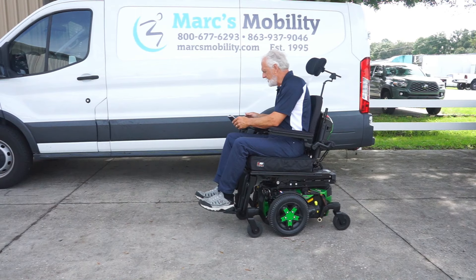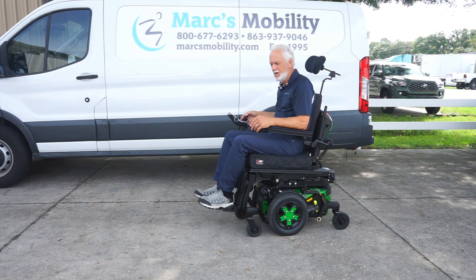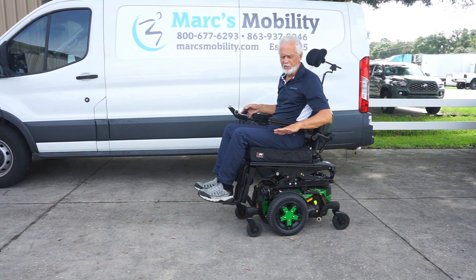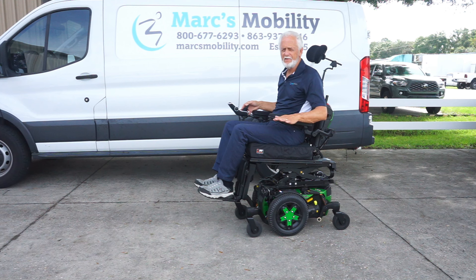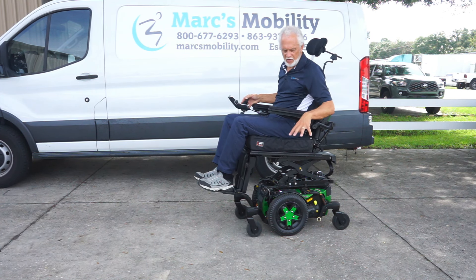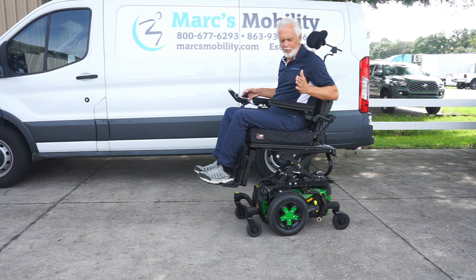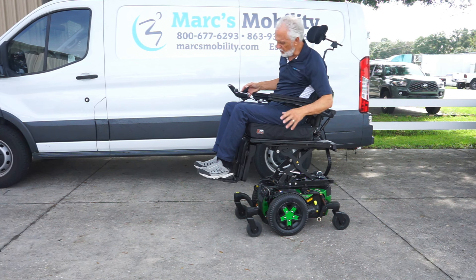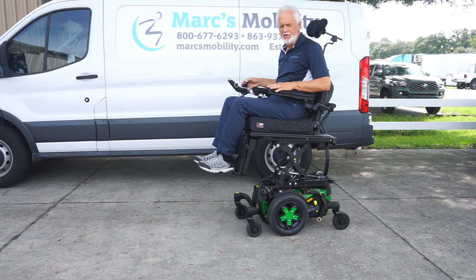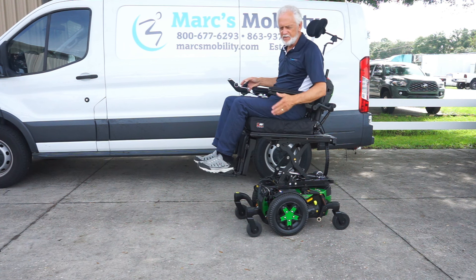I'm going to elevate the seat so you can see me driving the chair with the seat elevated. If you're going to drive with the seat elevated, please use a nice flat surface. When you work with a chair like this in your kitchen, you don't come forward — you come in sideways, so the sink would be on the opposite side of your joystick and you don't get it wet. If you're going to do any dishes, you come in from this side.